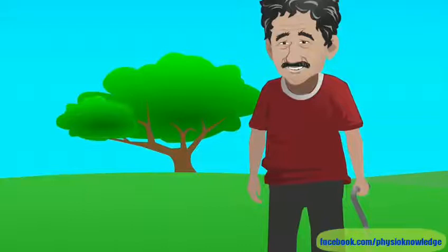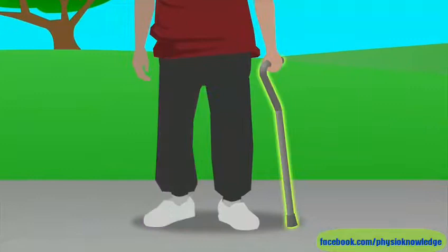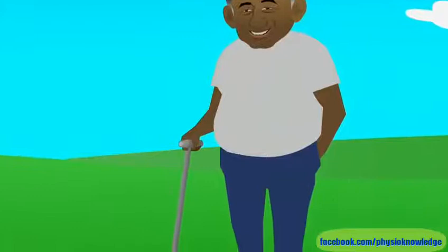Which hand you hold your cane in makes a difference. If you're using a cane because one leg is weak or painful, hold the cane on the opposite side from the weak leg. If you're using a cane for a little balance and stability, you can hold it in the hand you use less.